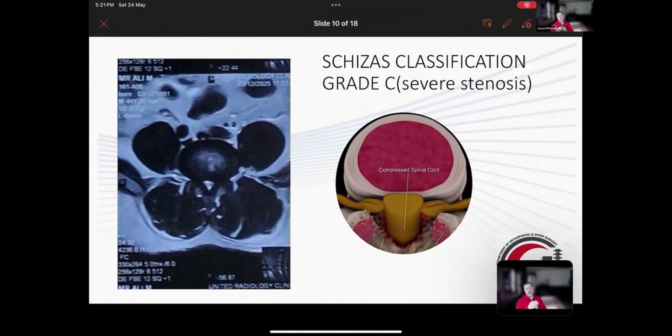Now, the next question I asked was interlaminar versus transforaminal. I'm not sure that anybody here would go transforaminal in this case because you cannot get an adequate central decompression there. Your transforaminal approach is going to be nice for a paracentral or foraminal disc. Also, some facet hypertrophy, because you can do a little bit of a facetectomy from the transforaminal approach and get a little bit of the lateral recess. But I think in this situation, just about everybody here would go interlaminar.